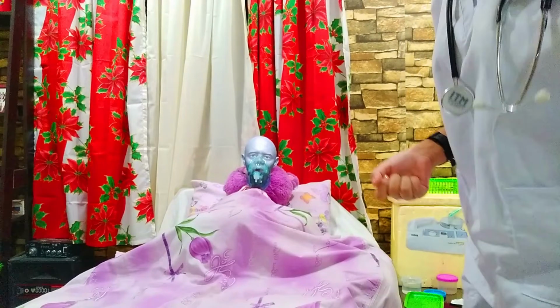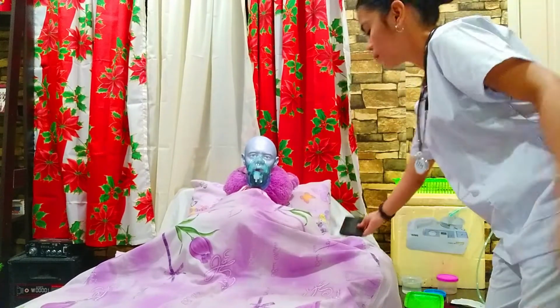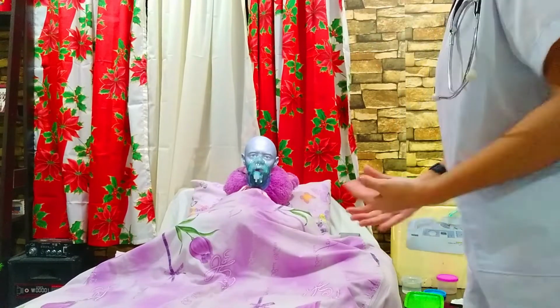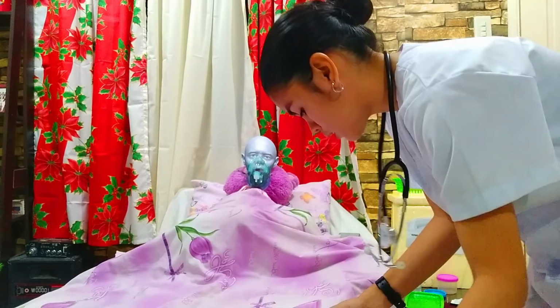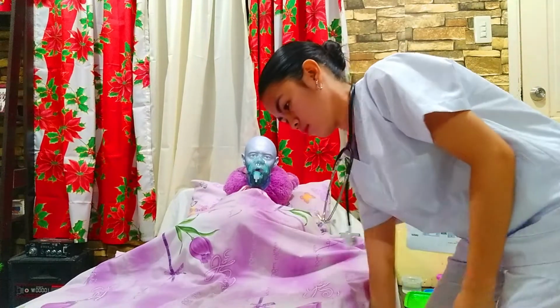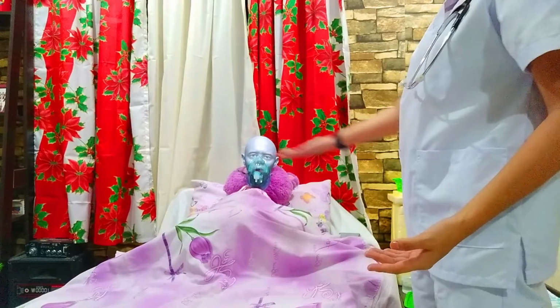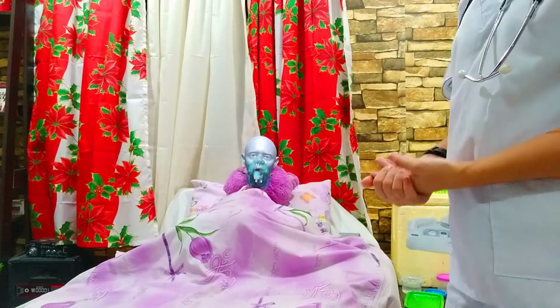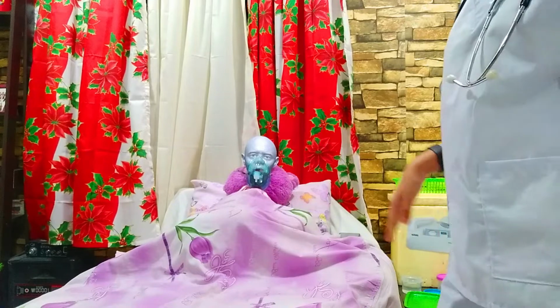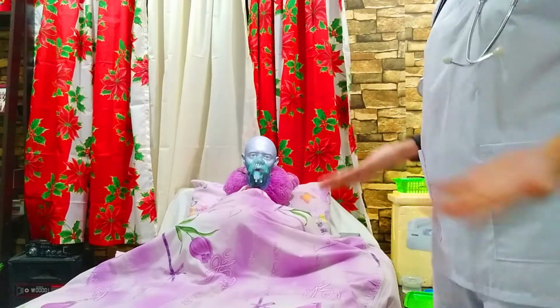First is the call light. We need to put this within reach of the client. And then the bed, low and locked. And the side rail secured. And the room risk-free for falls, and free from any obstacles. And then perform hand hygiene.